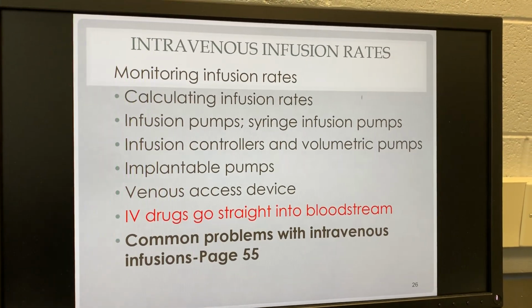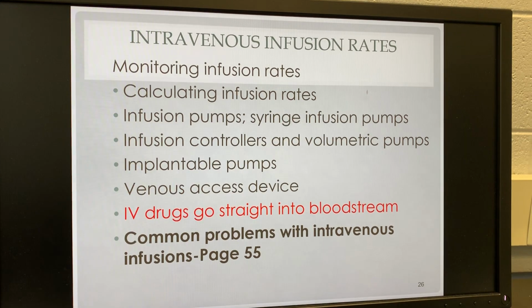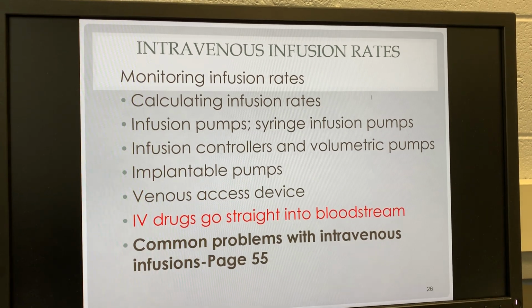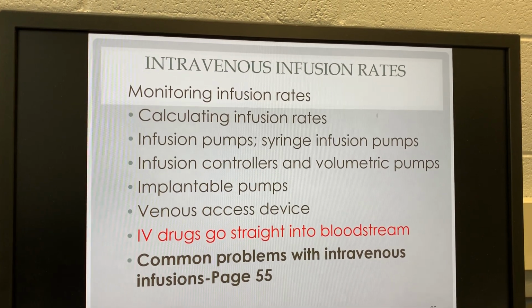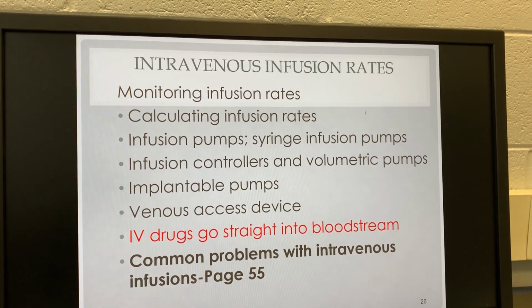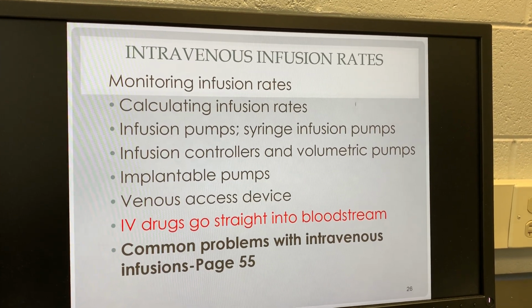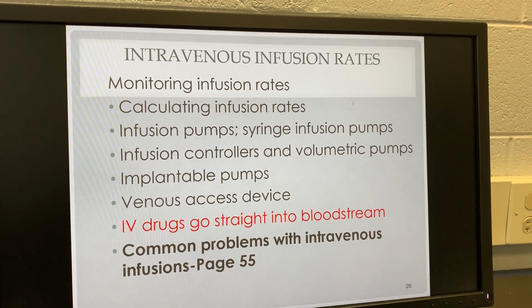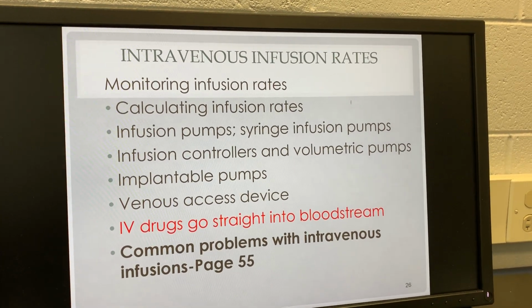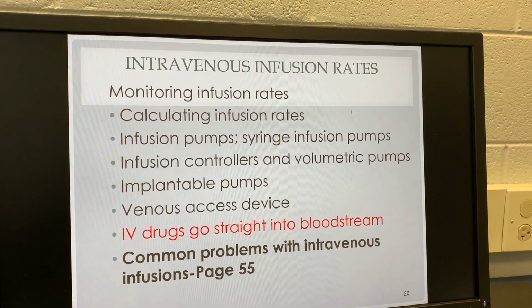We've already done math. We've talked about monitoring infusion rates. You've learned how to calculate infusion rates. There are going to be various pumps that you work with. We'll get to work a little bit with pumps in IV, in MedPass clinical. But there are lots of different kinds of pumps, and every place you work will have different pumps. There are implantable pumps that can be planted under the skin, like insulin pumps and other kinds of medications that either go sub-Q and the pump is on the outside, or sometimes there's an implanted pump on the inside of the skin.